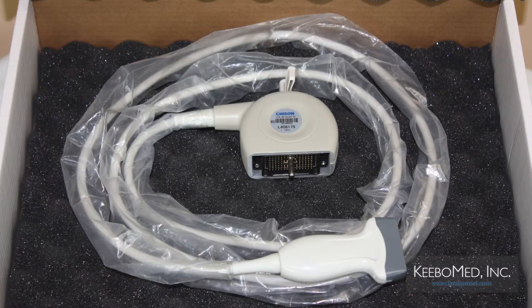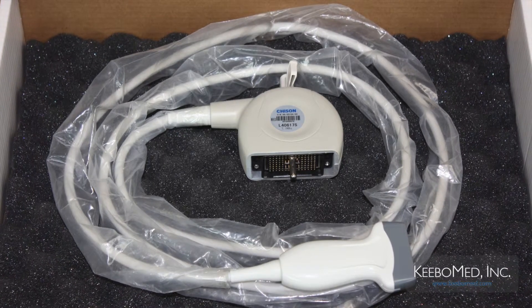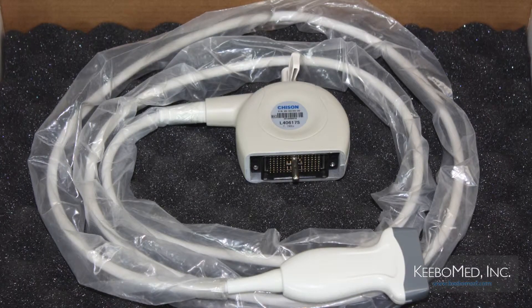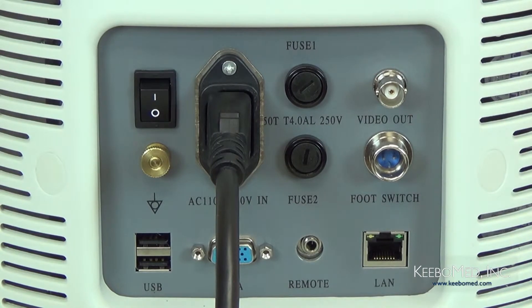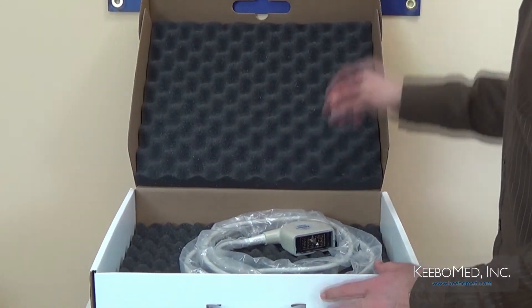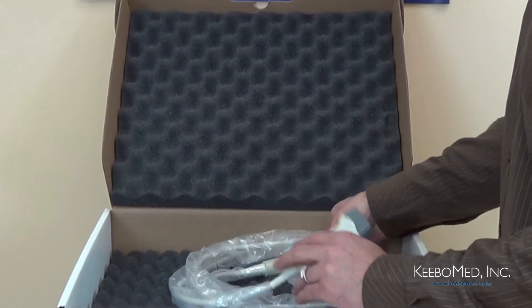Now we're going to consider the proper installation procedure of the probes. Remember, it's important to only use the probes that are provided by the manufacturer for the 8300. The first step is to make sure that the unit is turned off. Step 2, open the probe box and carefully check the probe lens, the cable, and the connector to make sure that it is in proper working condition.